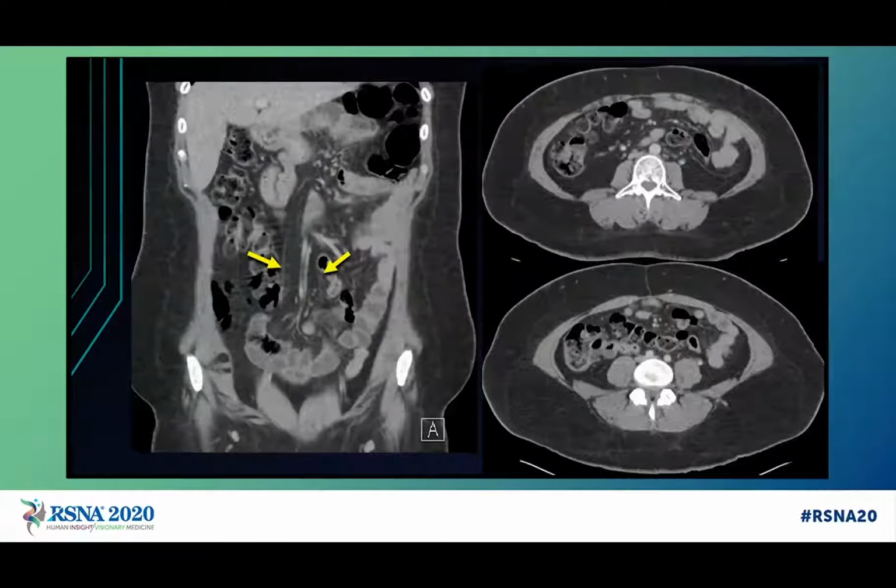This is a much more subtle case of a patient who has an internal hernia. This is a gastric bypass patient. Notice that there is small bowel that looks draped over the transverse colon, but more importantly, notice that the transverse colon is touching the iliac bifurcation and is located behind the small bowel mesentery. It's really not a normal anatomic relationship of the transverse colon to the small bowel mesentery, and because of this patient's high-risk anatomy, she was taken to laparoscopy the next day, and an internal hernia was confirmed. This was not obstructed or ischemic, but certainly was at risk for both.